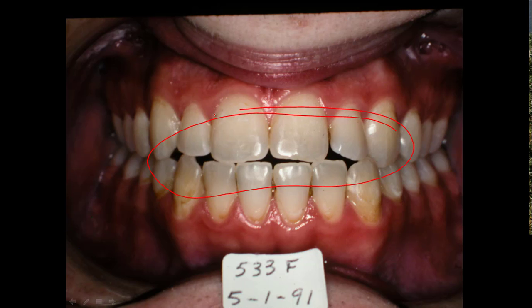Now this retention, this type of retention here, don't turn your nose up at it, because you can do some young men. I've had young men I treated when they were at 12, 14, or 15, and finish them up good. And then when they get, say, 18 or 20, I've even had young people grow even after they were 21 years of age, and it would relapse. In other words, the bottom jaw would go into a crossbite out here. But if you know how to put class 3 retention on and put a retainer in there, now there's nothing crossing the occlusal surface of those teeth. And there's darn few people doing orthodontics really know how to do this class 3 retention.